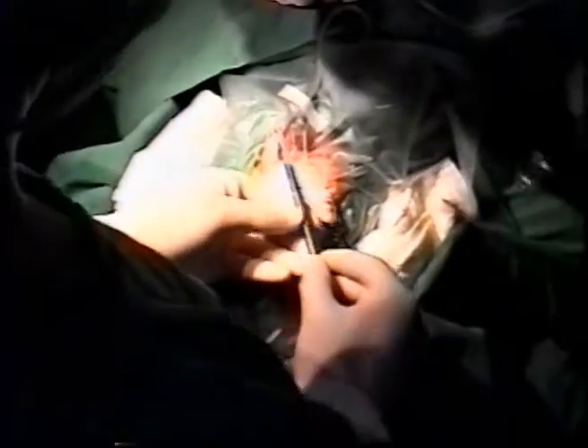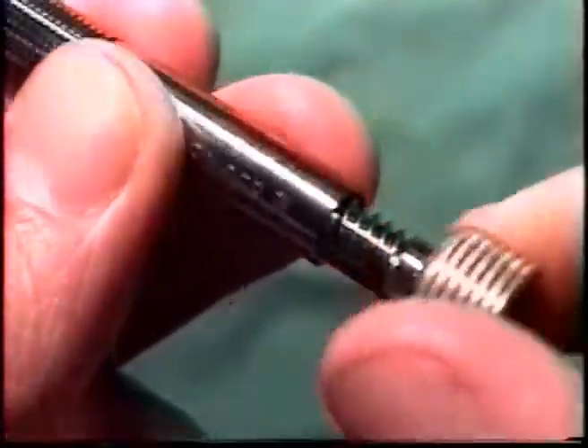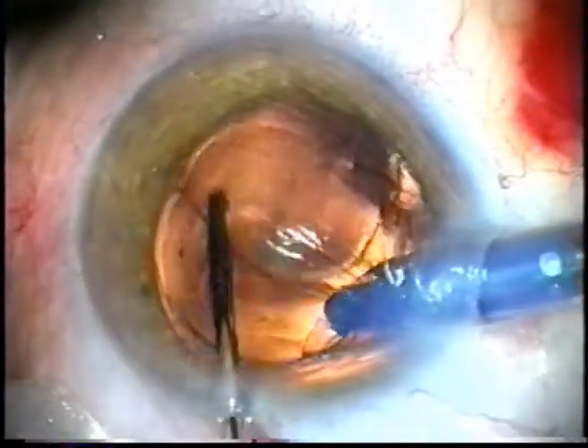Current precision intraocular lens injector systems require the use of both hands during the injection process. While one hand holds and rotates the body of the injector, a second hand has to twist a threaded plunger in an opposite direction to push the IOL into the eye. This combined action distracts the second hand from stabilizing the globe and guiding the IOL and trailing haptic into the capsular bag.